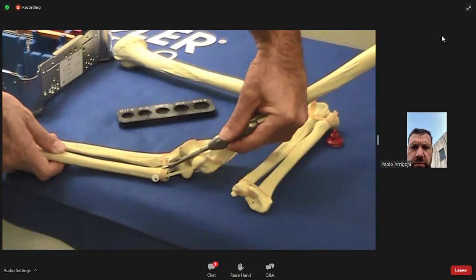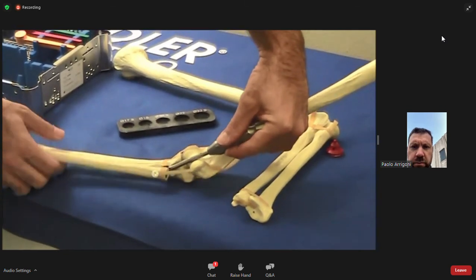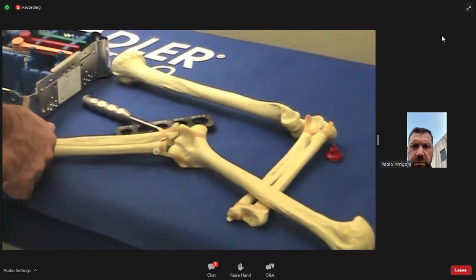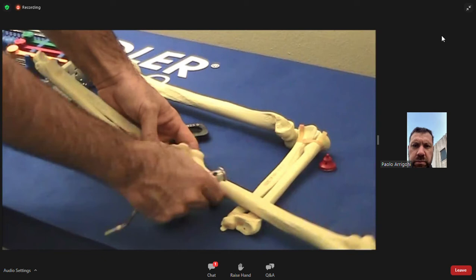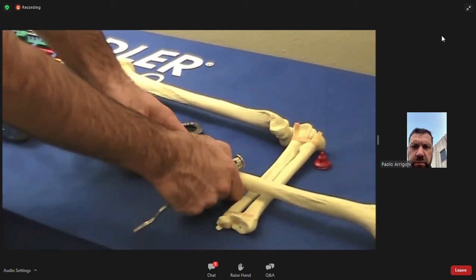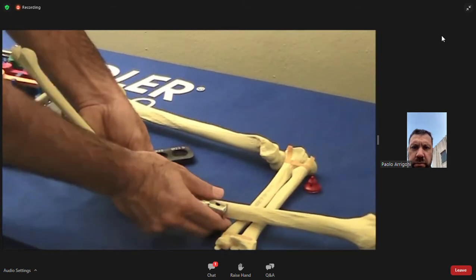In this way, my broaches are going to work almost in a straight direction with respect to the radius, because the radius is dislocated posterolaterally, and the broaches are going to work in this way.